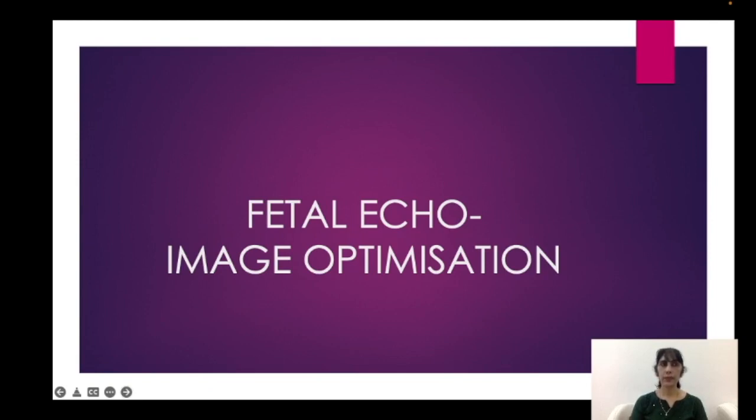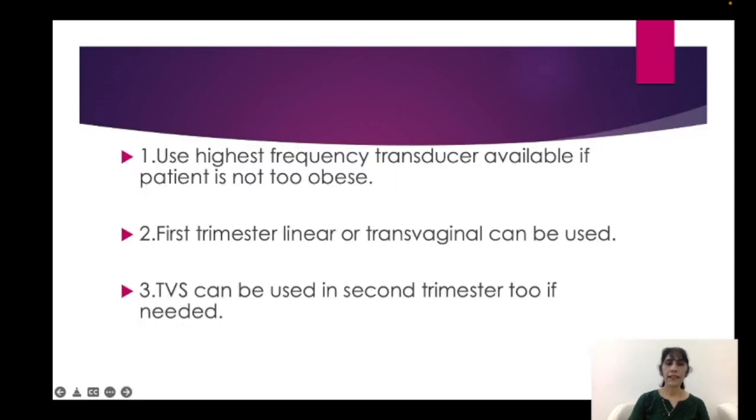I will straight away be moving to fetal echo optimization. So definitely when you are doing 2D ultrasonography or Doppler, there are certain basics which you are aware of that you have to do to adjust the machine properly and to get proper pictures and proper displays. The same thing is there for fetal echocardiography. There are certain additional points which we need to keep in mind whenever we are going to do fetal echocardiography, which would help us to get a better display and to interpret things in a better way. So before I go on to all the other things, let us just revise these few points which would be useful for us when we are doing fetal echo.